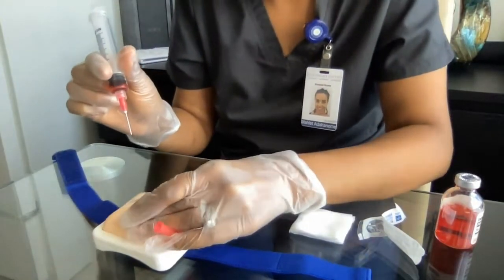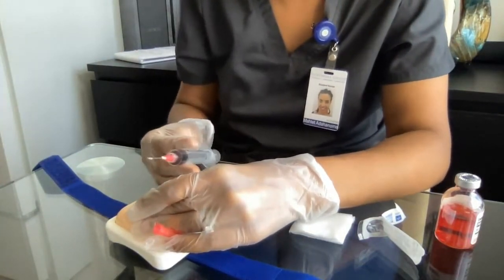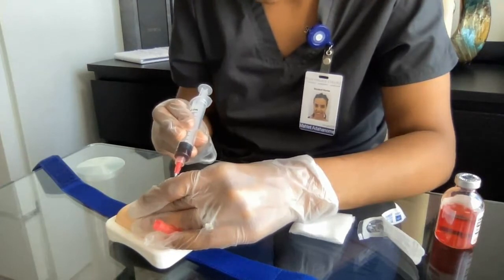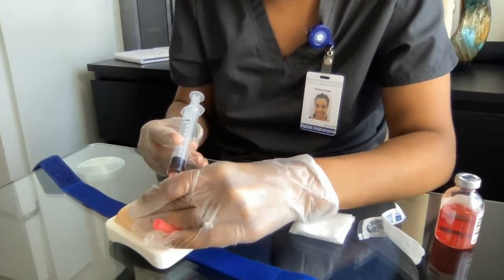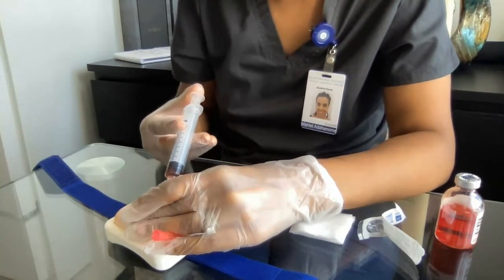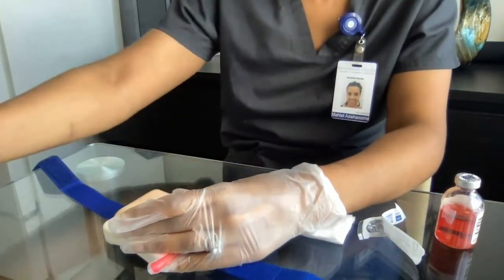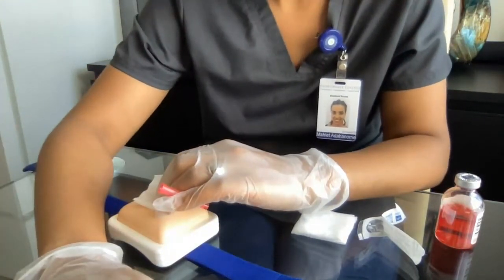Then I'm going to pinch the skin after it dries, and I can use a 45 degree to 90 degree angle. So I'm going to inject my medication. As I insert the needle quickly, I release the skin, and then slowly inject. After releasing the skin, I take the needle out.